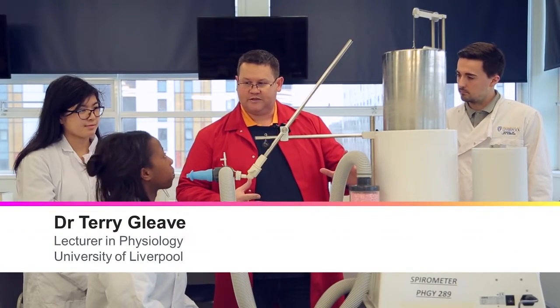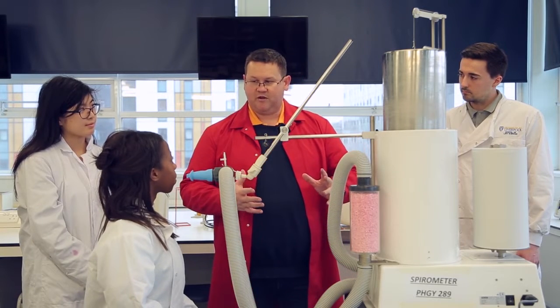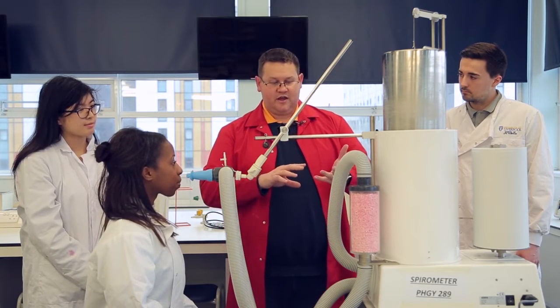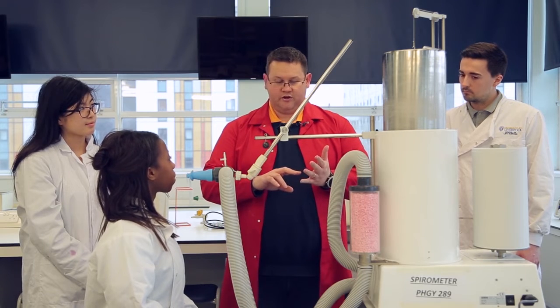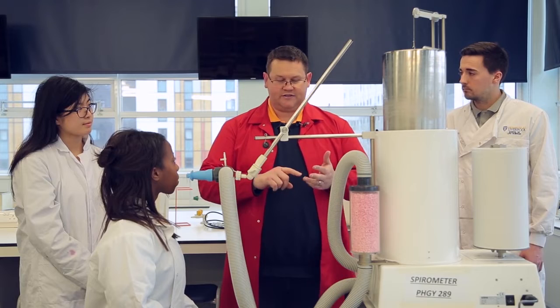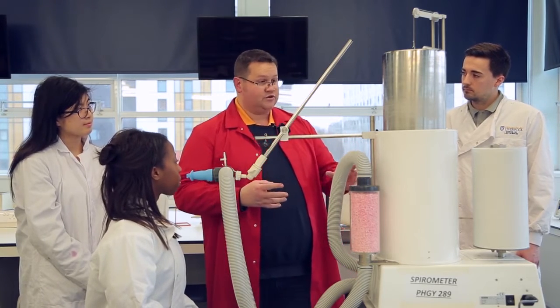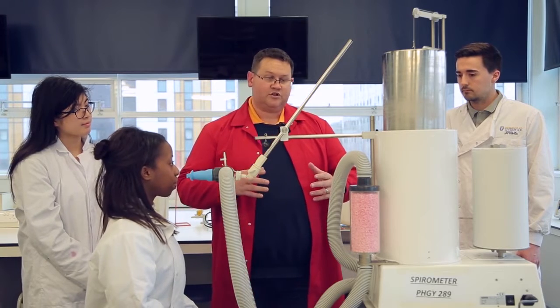We've got the Benedict Roth spirometer, and it was one of the ways, before we moved into a digital age, where we'd be able to look at the air volumes of the lungs — looking at your static volumes, so things like tidal volume, inspiratory capacity, expiratory capacity reserves, and also vital capacity. What we're going to do is use a Benedict Roth spirometer to look at your breathing.